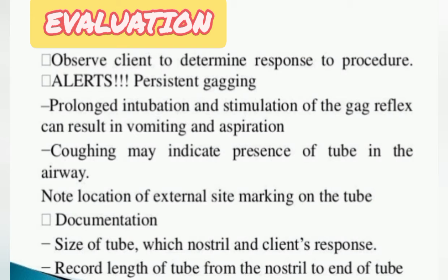We have to note the following important points. After insertion of the tube, documentation is necessary: the size of the tube, which nostril, and the client's response. We have to record the length of the tube from the nostril to the end of the tube.